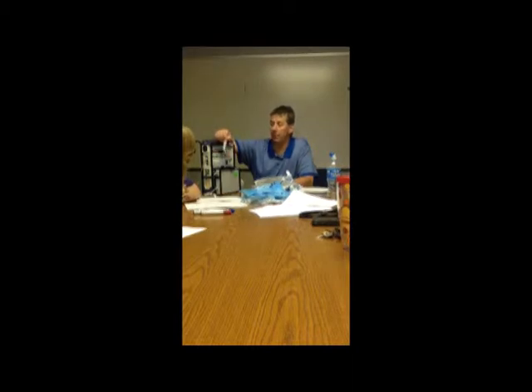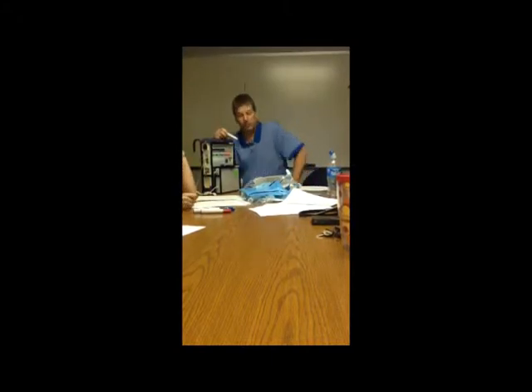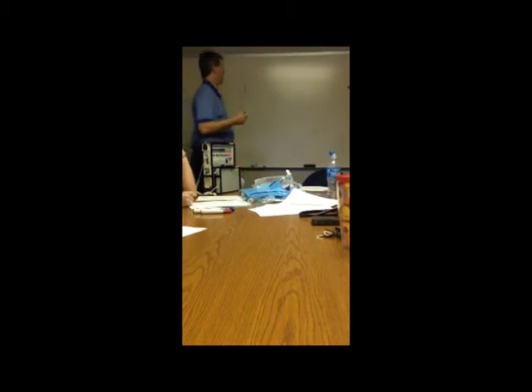So when you're getting settings from a therapist, a nurse, whoever at a small hospital, and they're on volume ventilation, ask them what the measured I-time is. You can enter that here, and it will basically calculate the same flow that they're using on their machine. They're going to set it on a flow of 60, and then they're going to measure the I-time. Your machine is different. You set the I-time, and it dictates the flow, all right? So that's a little bit different than our ventilators or any others. That's actually a nice feature, but you have to kind of treat it a little different.